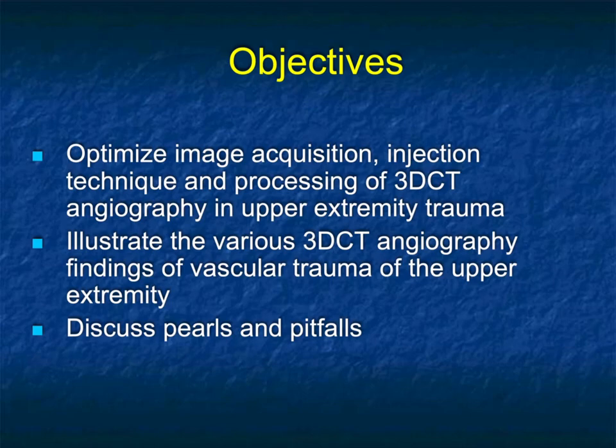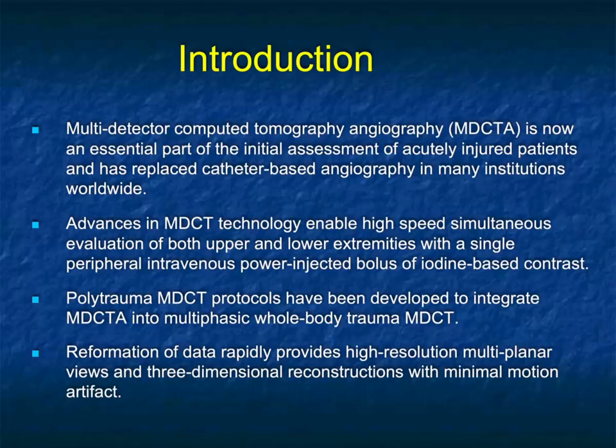We're going to talk about and focus on CT angiography. We're not going to speak about skeletal trauma per se. We're going to focus on the angiographic evaluation and discuss some of the challenges we come across.